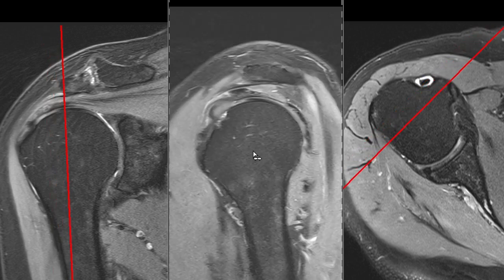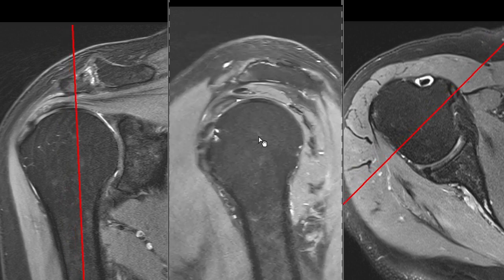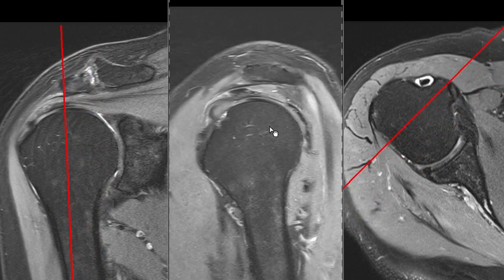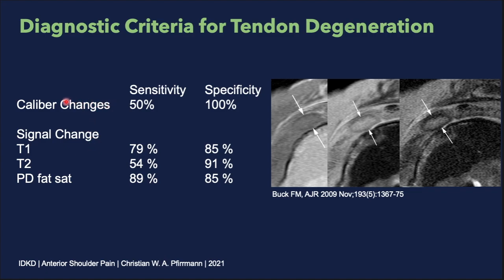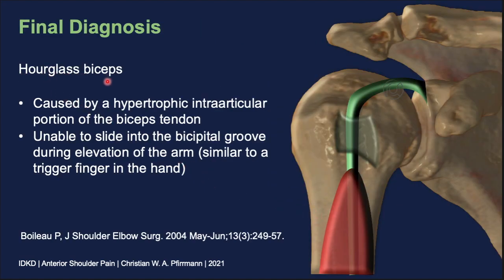So let's summarize our findings. We have a marked enlargement of the long biceps tendon, calibre changes, and signal changes in the long biceps tendon. The findings of calibre changes and signal changes are diagnostic for tendon degeneration or tendinosis. Especially the calibre changes have a very high specificity. However, we have a second finding: in our case, the marked enlargement of the biceps tendon is termed the hourglass biceps.